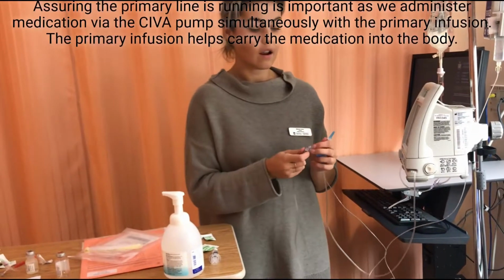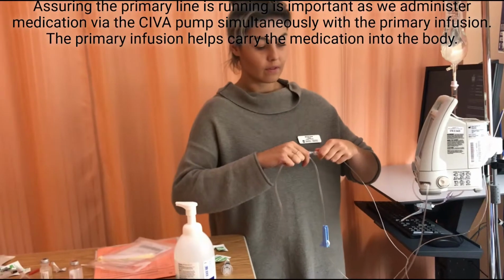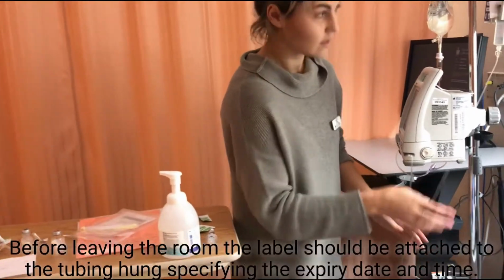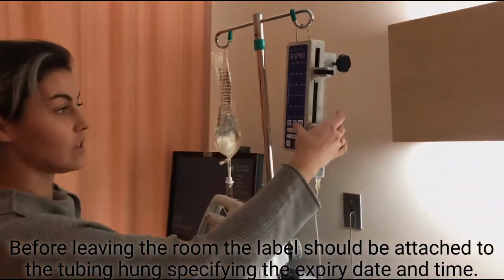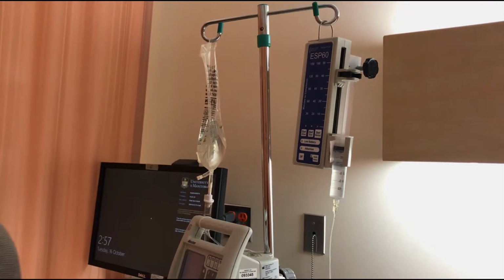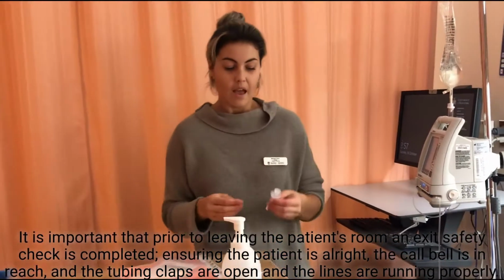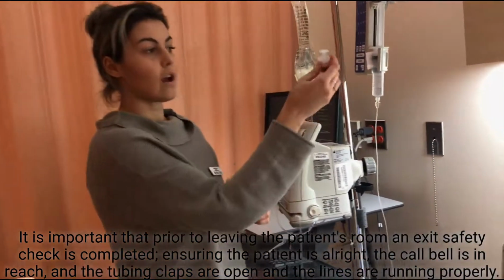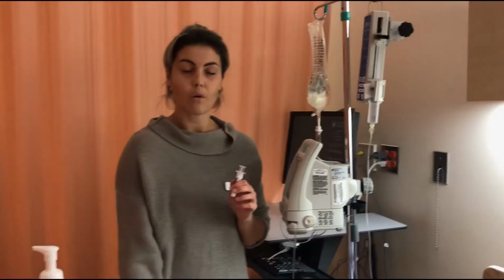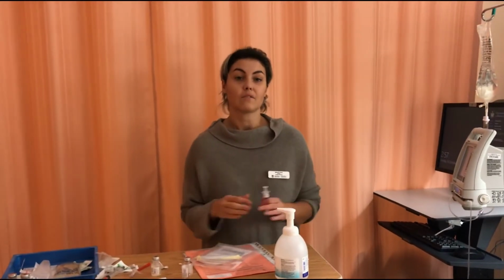So 30 seconds again there, and 15 seconds to dry. Attaching this here and pressing start. Seeing the green light flashing ensures that it's running, and then at the end, after it's finished infusing, I will come back. After the 35 minutes, I will flush the line with a 3 ml syringe of normal saline at the same rate, just to clear the line to ensure no medication is missed. And then at the end, I will just document that I gave the medication.